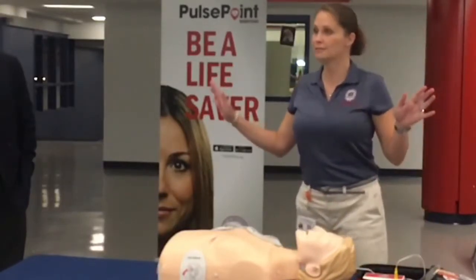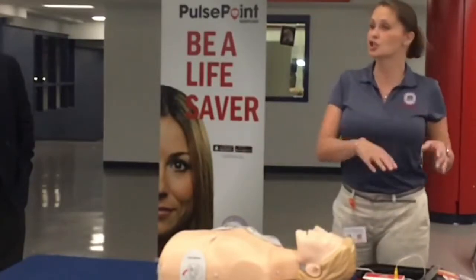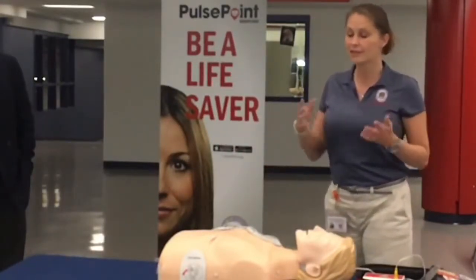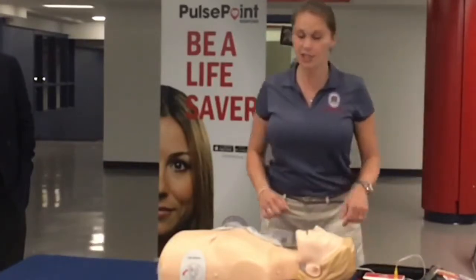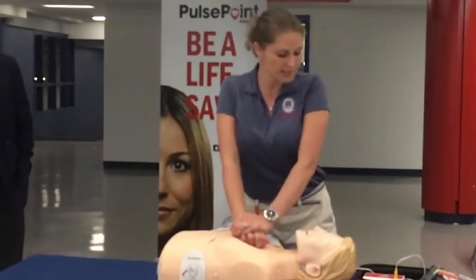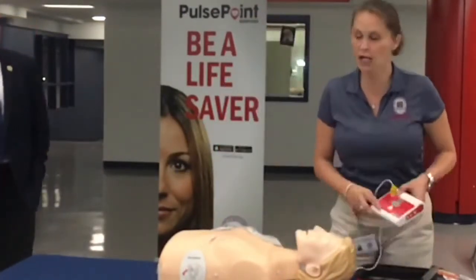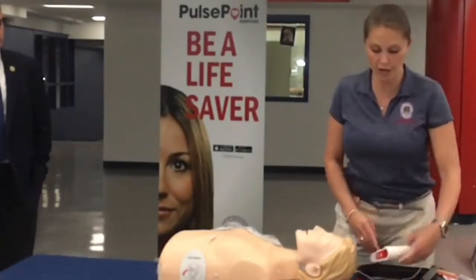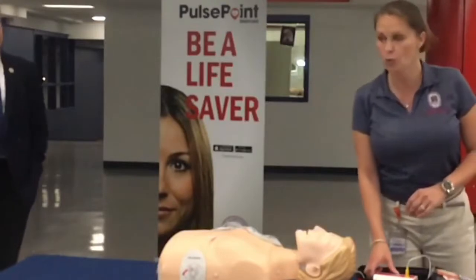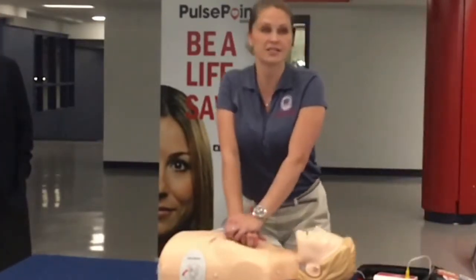We want to make sure that nobody touches the patient, because we want the machine to determine what the patient's heart rhythm is, not ours. This patient needs a shock. It's going to charge, and it's okay to do CPR while it's charging. But once it's ready and the shock light lights up, we want to make sure that everybody stands back. Please, everybody stand back. We're shocking. Shock delivered — and we're going to immediately start CPR again.